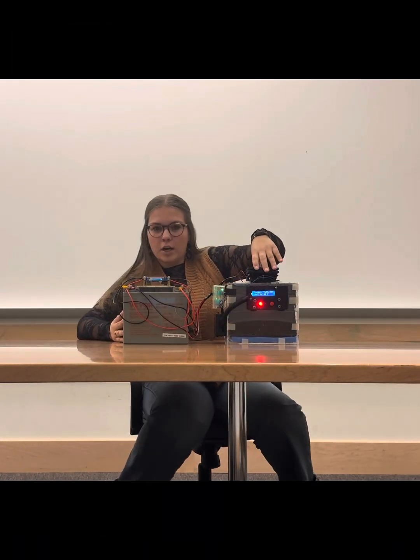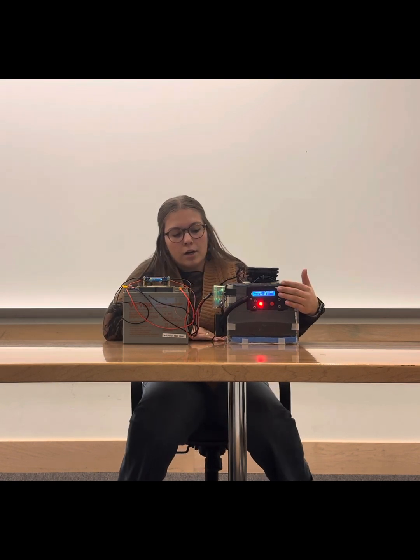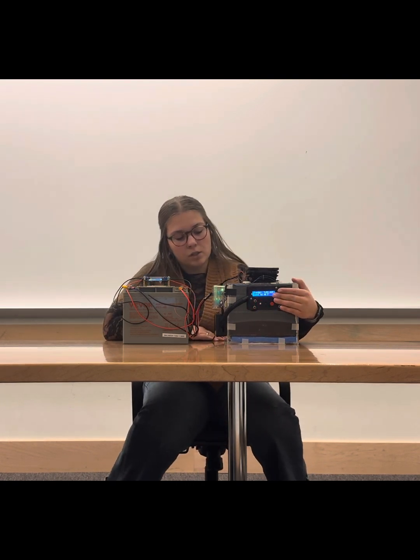So we have the fan at the top and a fan on the inside also, which are connected to a relay that is seen on the side of the box, and then we have the Peltier connected to a different relay, and those are powered by the battery. The Peltier runs through this transformer device, so we are able to change the amperage and voltage going to it. Our LCD screen and buttons and buzzer also are connected to the Arduino that is in this lower box right here. And we have a ton of wires in there that wire the different components, so we are able to run the components through the Arduino and through the code.